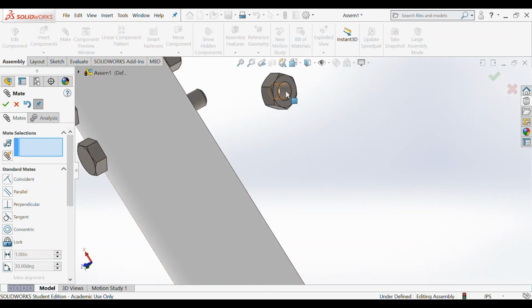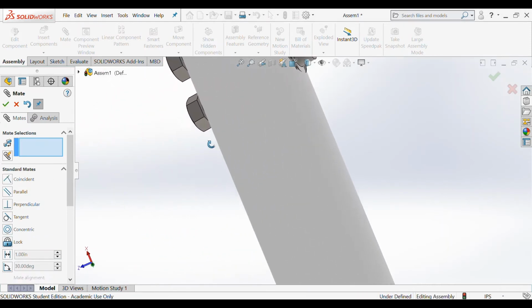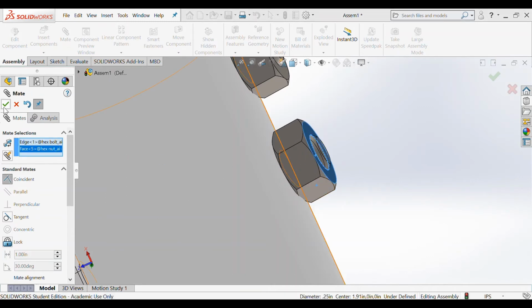And we're going to choose the inner circle and the outer circular face. We're going to make them concentric. And then I'm going to drag it up a little bit to make it a little easier to mate it. I'm going to choose this outer circle right here and the face of the nut, and then make them coincident.